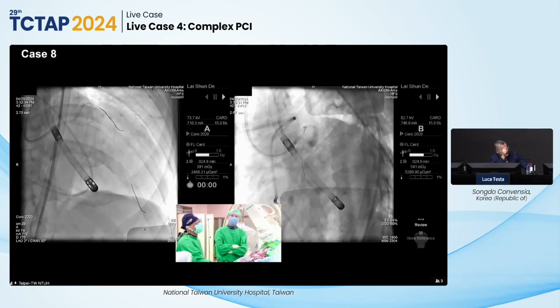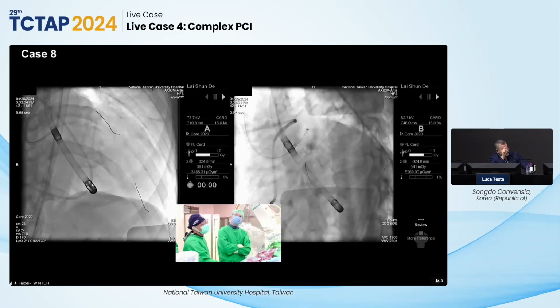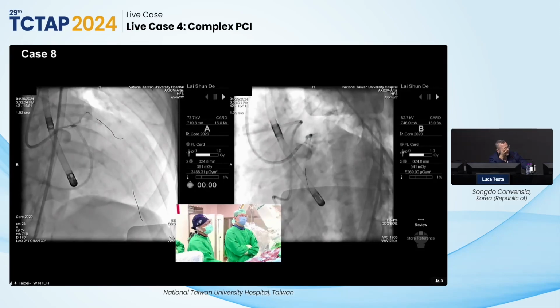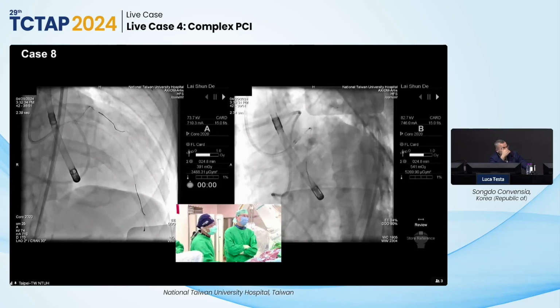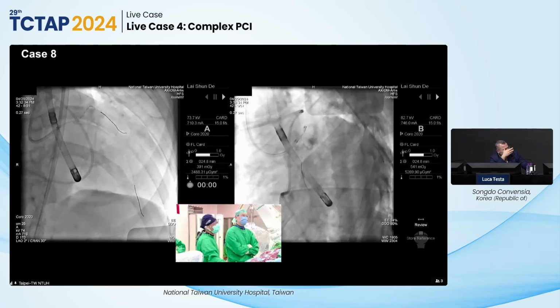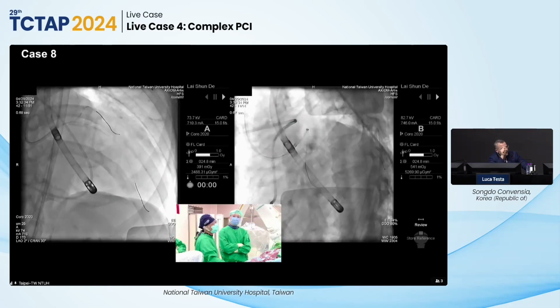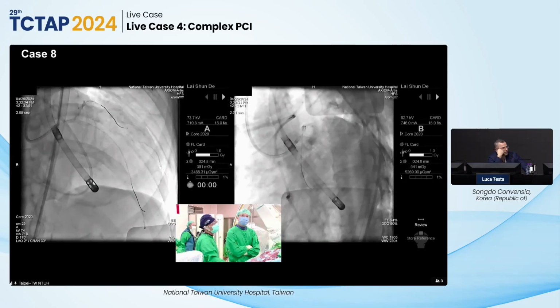If we just put a stent, left main, LAD, and then we try to save another additional stent to the circumflex, we probably do the job for this patient, because honestly, I'm not sure that this wall will recover. So instead of taking the risk of long-term problems from stent failure, we'll probably just put one stent. According to the IVUS, with all the post-dilatation that we need to do, I will optimize the stent to the left main, and that's it. Honestly, I will try to keep the procedure as easy and as fast as possible. Yeah, one long stent, I agree.